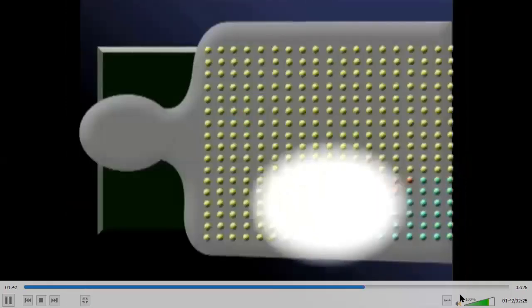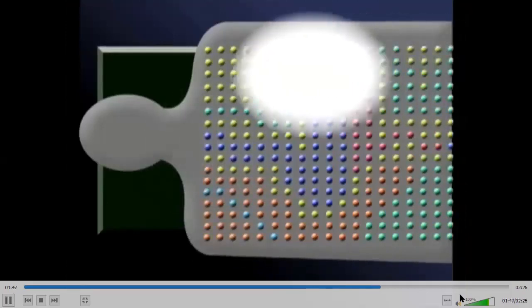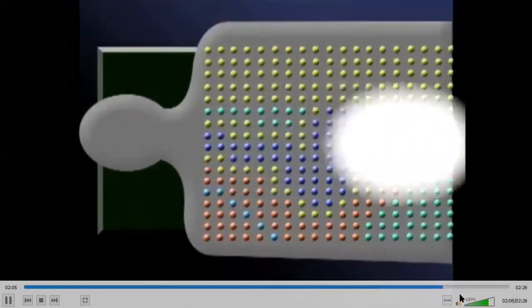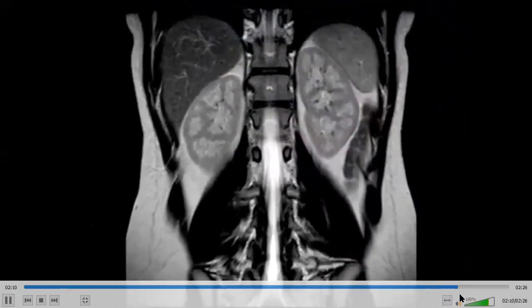That's why in an MRI machine you hear boom, boom, boom. It's all these pulses that we put on with different strengths of magnetic field, perhaps even different directions, because we want a three-dimensional picture of you. You record all of these data, and when you finish, you use what's called a Fourier transform, a mathematical technique. You can work back to how strong the signal was in each of these voxels. This is how the image is developed.